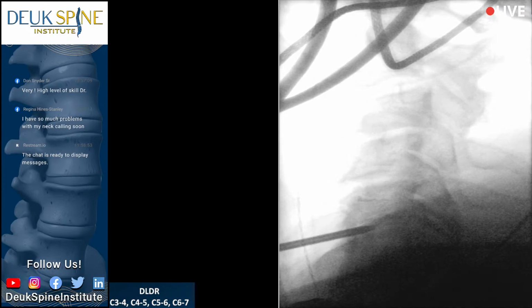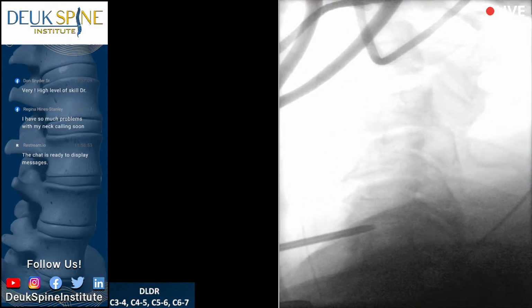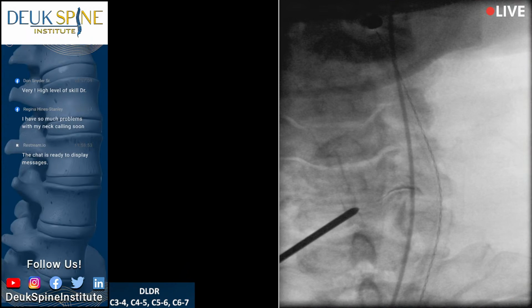Yeah, okay, that's pretty good. You can see the dye going out the crack in the back. And give me an AP. Coker. You can relax. Remember, always come off slow. Yes. Shot. Bam, look at that. Dye going out the foramen. See it way over there? It's crazy, huh? Looks like a mustache over in the foramen. All right.